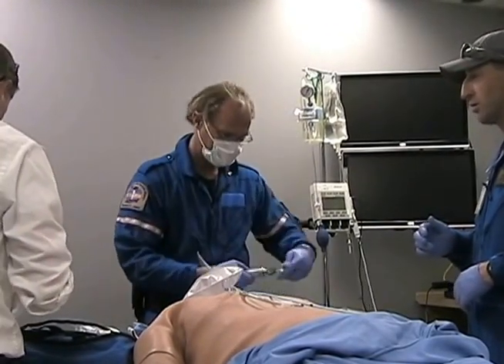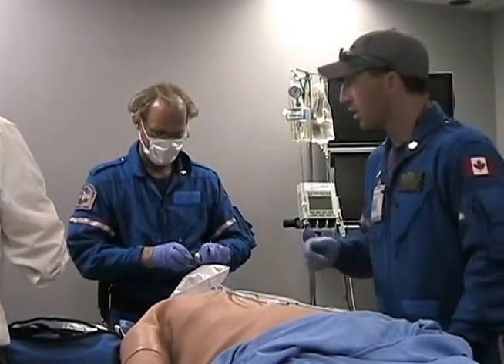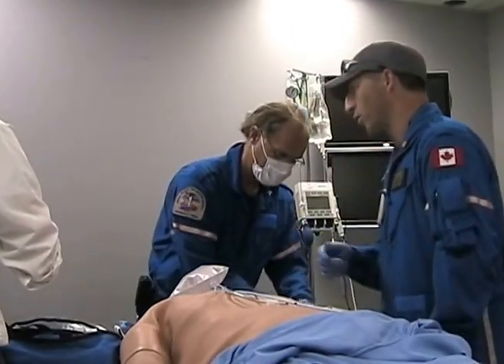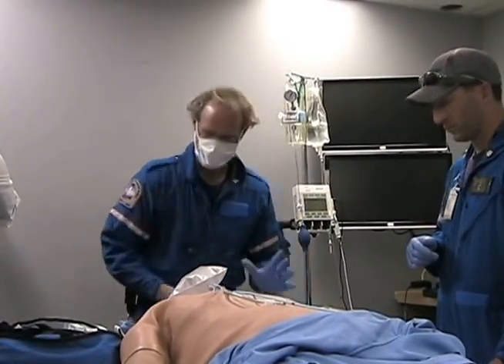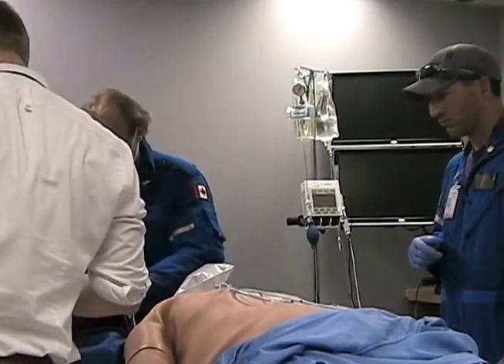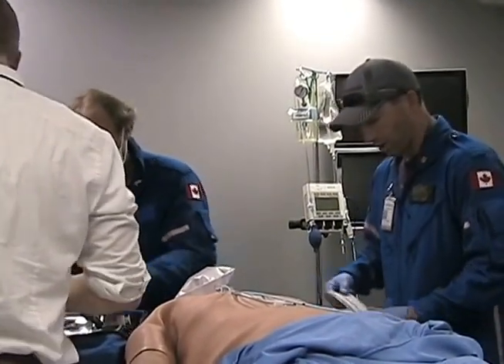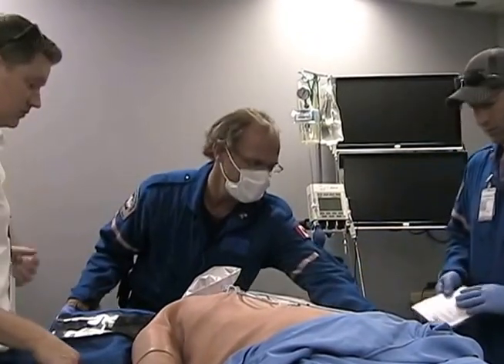Awesome, I appreciate that. Bruce, you got all the drugs going up there? I sure do, yeah. And you asked me to have the BVM ready. It's ready to go and the PEEP valve's on. Okay, yeah, James just added that circuit on there. That's good. If we have the CMAC, we have the CMAC here. Other than that, I think we're ready to go. You got all the drugs you said, right, Bruce? Sure do. Awesome. Well, we'll just get the OG out here. Put it right down there beside you where you're going to be.